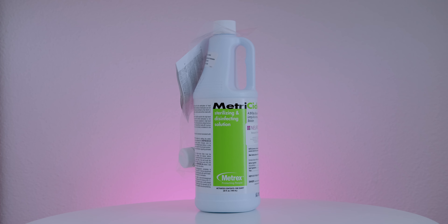For those customers that wish to do a cold sterilization, we recommend using Metricide 28, a fantastic cleaning product for caps. Use it according to the manufacturer's instructions on the packaging.